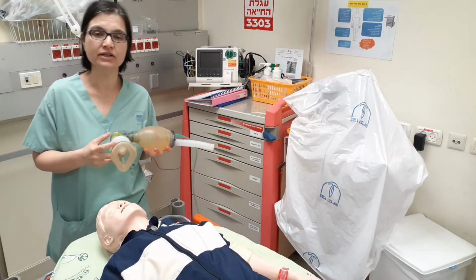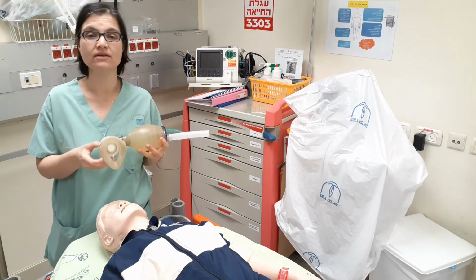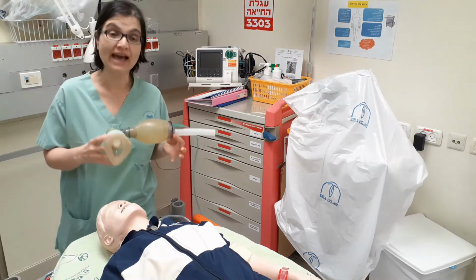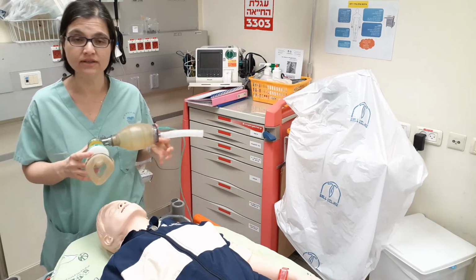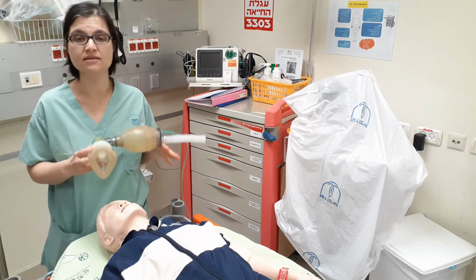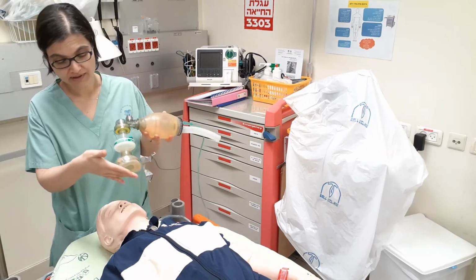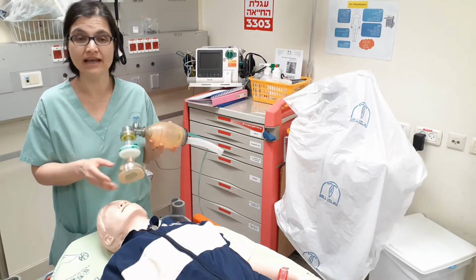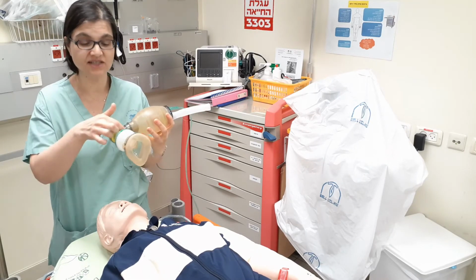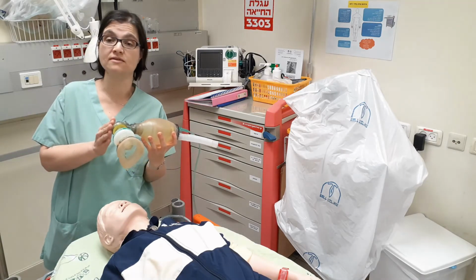Key points regarding using Ambu mask ventilation in pediatric patients with confirmed or suspected coronavirus infection. As a rule, it's better to avoid Ambu bagging these patients. The Ambu mask is an open system. Aerosol is generated from the area between the patient and the mask, as the mask is not completely sealing the face, and from the expiration area of the Ambu itself, as it is again an open system.